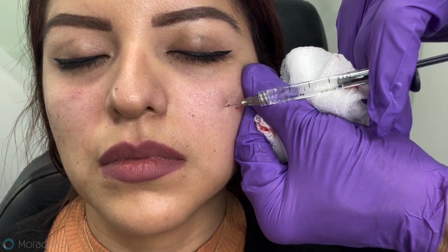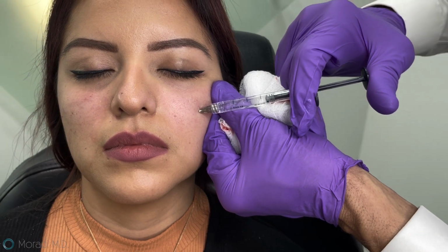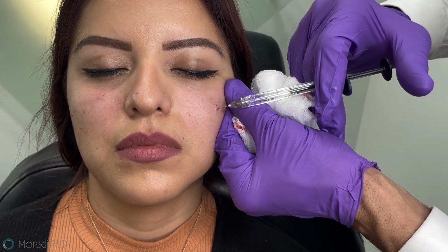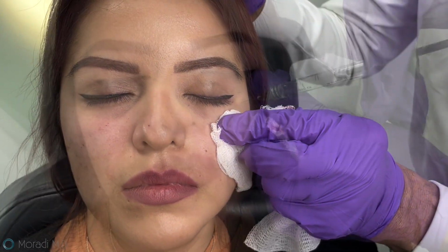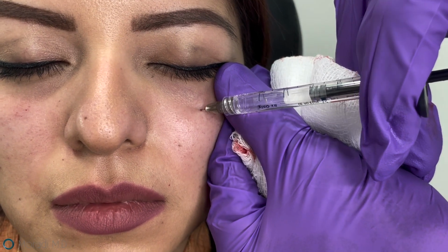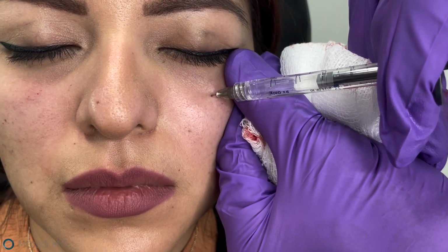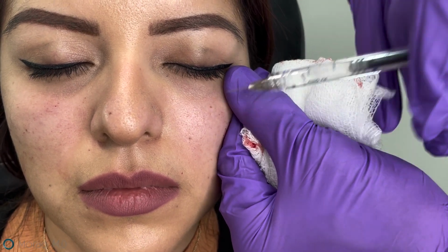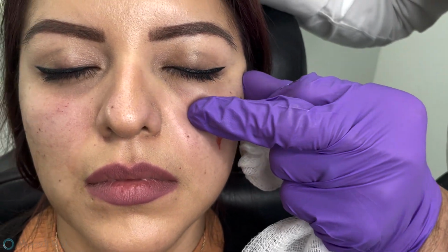What's important, if I feel any bounce back or slight pressure at the tip of my needle, I will reposition down to the periosteum in this area, just lateral to the infraorbital foramen, 0.05, exit, massage towards the foramen.